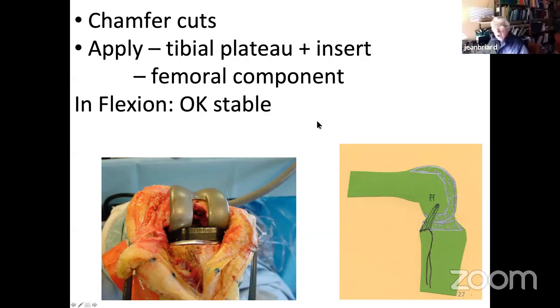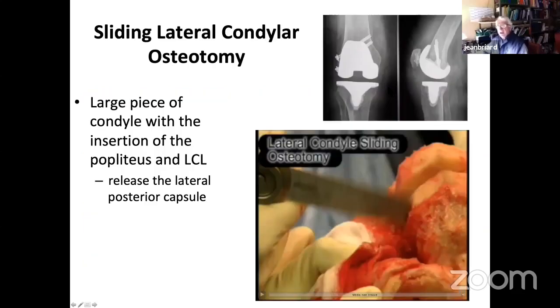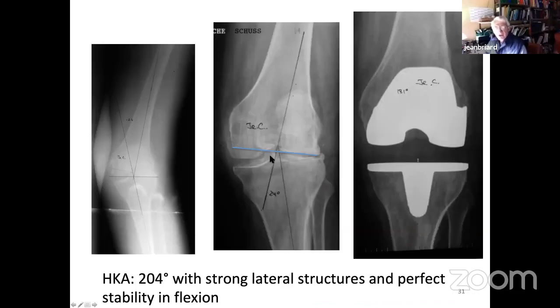But we can't extend the knee. And in order to extend the knee, you have to do a sliding lateral condylar osteotomy. That will be explained later by Rajesh, I think. So you see here the fixation, it's only 2 screws, and we can correct quite significant deformity. You see here 24 degrees, and I use a non-constrained knee. It's just a curved plateau.